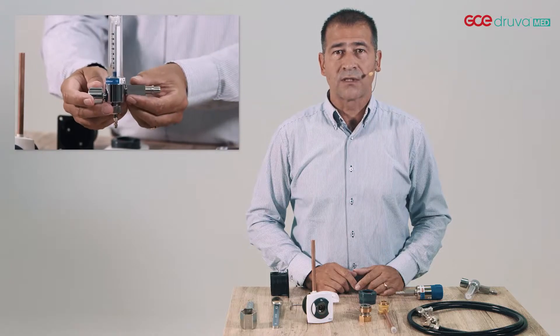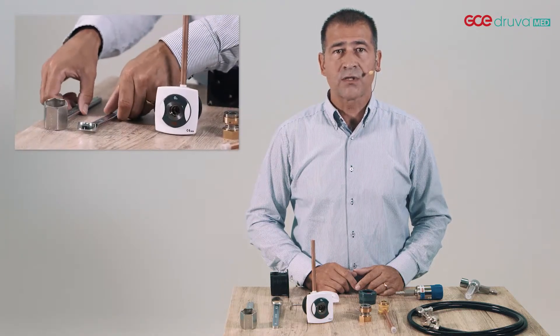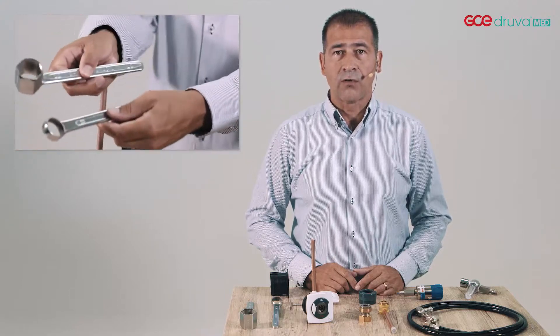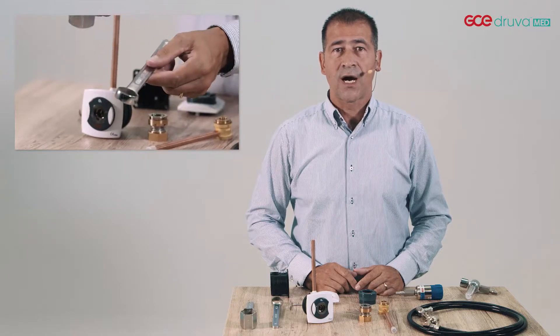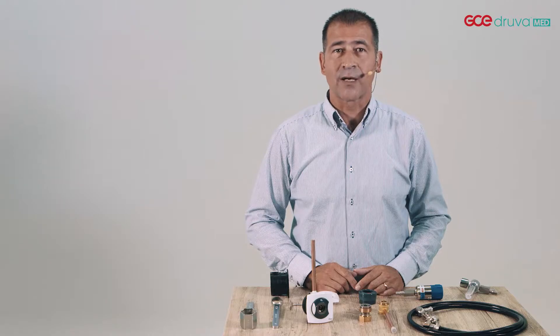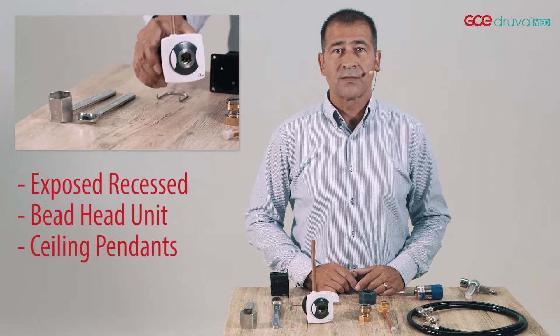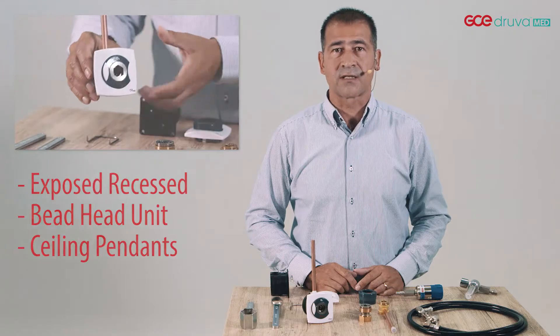GCE MediUnit is very easy to install and adjust by the use of special tools. So only qualified technical staff in possession of those tools are able and allowed to install, maintain, repair and disassemble the GCE MediUnit. The unit is available for installation exposed, recessed and integrated in bedhead units and pendant systems.